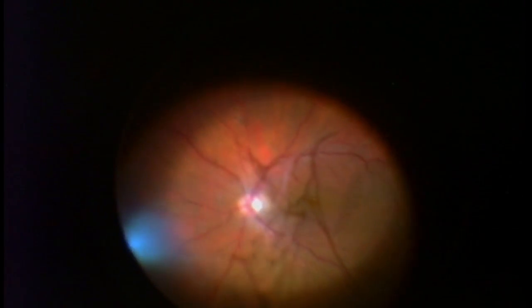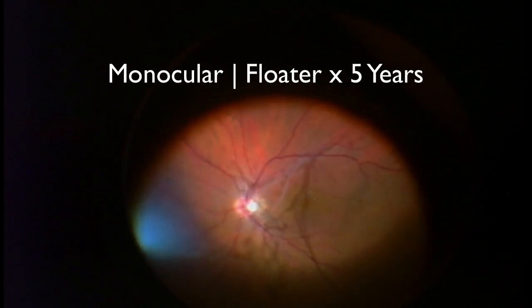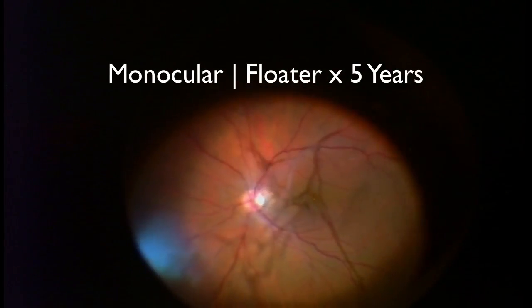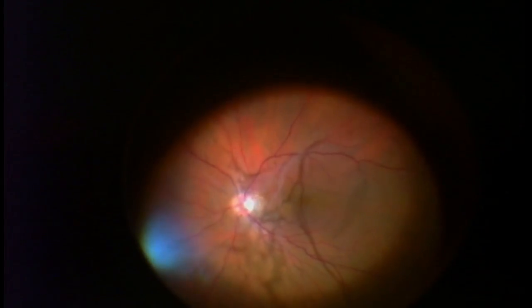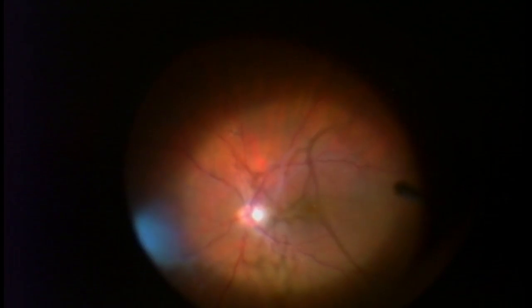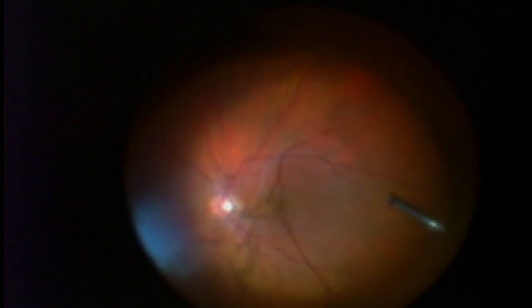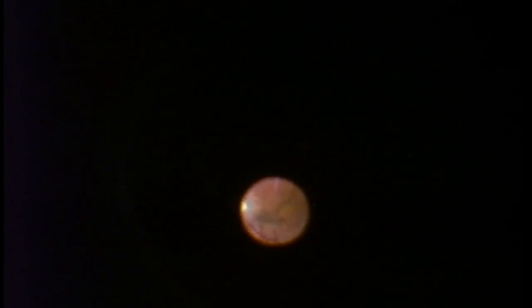This is a vitrectomy, which nicely demonstrates a very obvious floater in this patient who has had a PVD. This patient is monocular. She does not see well out of her other eye, and she's had a floater for over 5 years. And as you can see, it is very disruptive to her vision, as you can see the very large shadow that is cast on her retina.